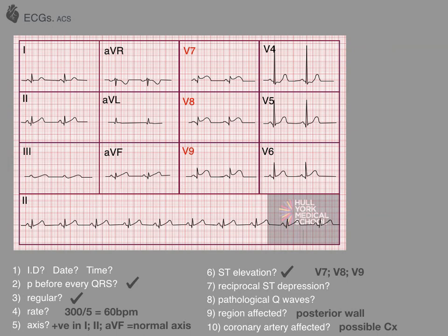When you print your new ECG, it will initially write those 3 leads as V1, V2 and V3. So it's important then to immediately mark them as V7, V8 and V9 to indicate that those are in different lead positions.